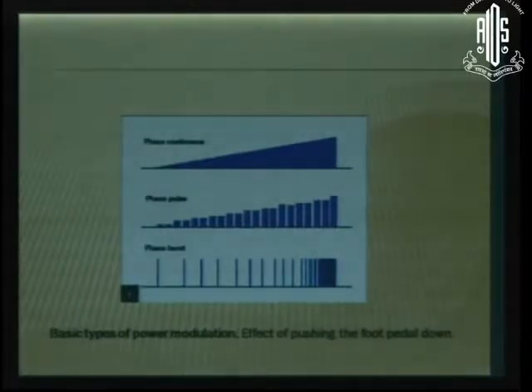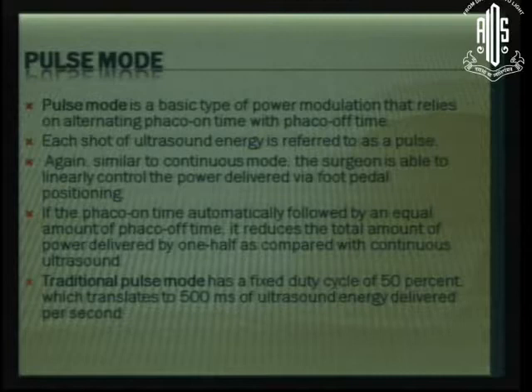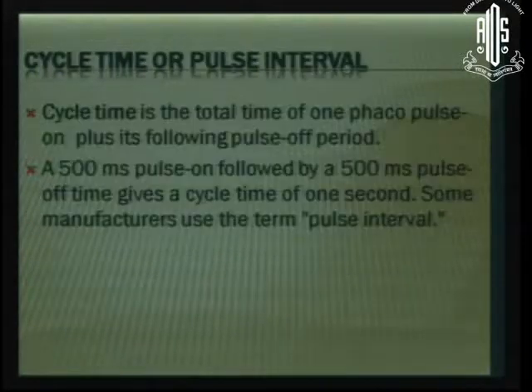Burst mode doesn't mean that it just goes on bursting away. Burst mode indicates that as you raise your power on your foot, you can manage to get larger and larger segments of energy which can be released at the same time. In a pulse mode, each shot of energy is called a pulse. And a pulse is a constant. You can break a pulse down.